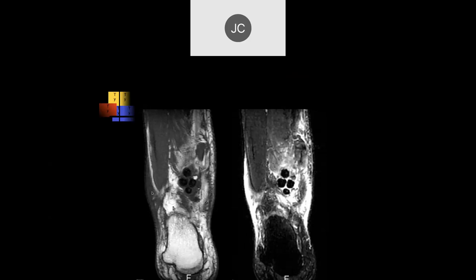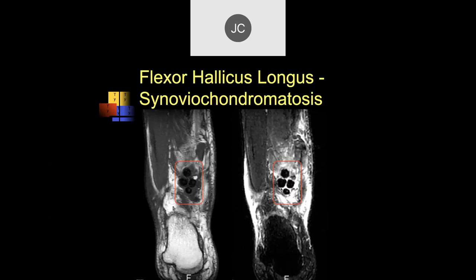There are a couple of low-signal bodies here, close to the midline near the calcaneus in the area of the flexor hallucis longus. This is synovial chondromatosis. The flexor hallucis longus should go between the sesamoid bones. On the coronal images we can see it with some fluid around it — this was tenosynovitis of the flexor hallucis longus.